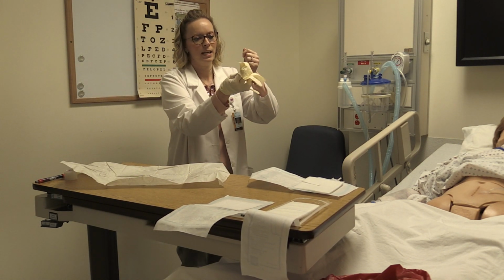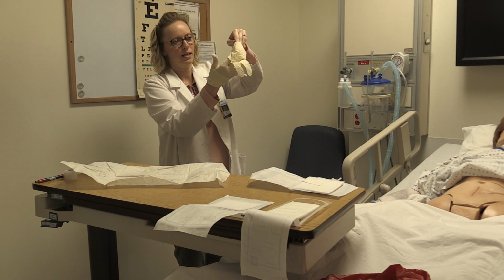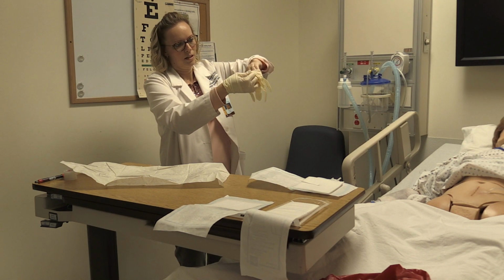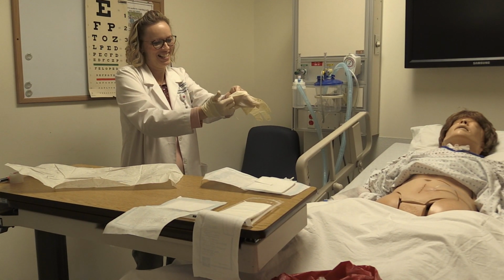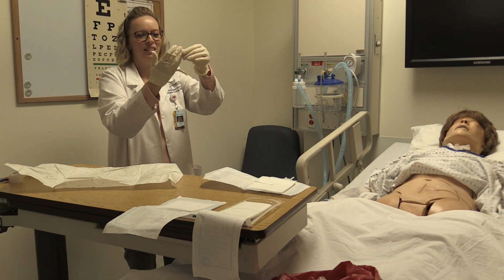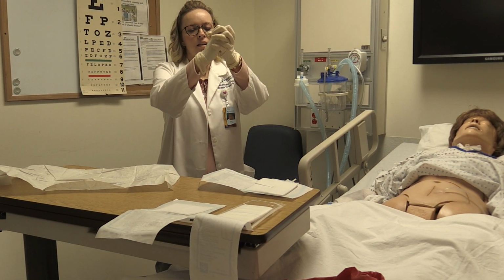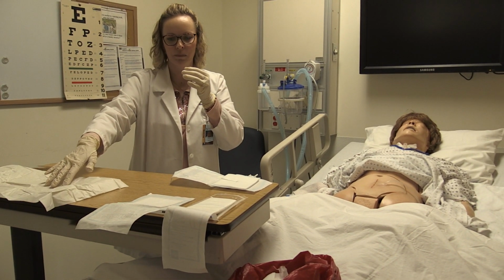I'm going to pull back here. My thumb is going to hitchhike. You know, we replace these gloves every year, every semester, and they still act like they haven't been touched. Now I can fix. All right. Pray you don't contaminate. All right, I don't need this, so I can move that.